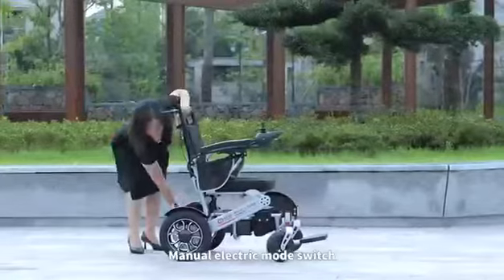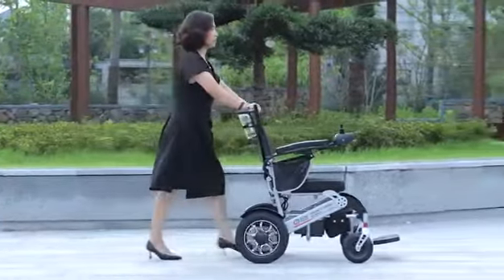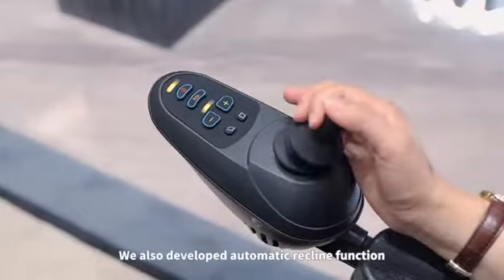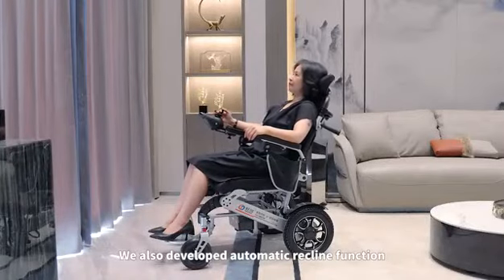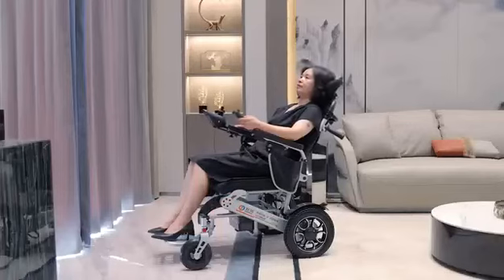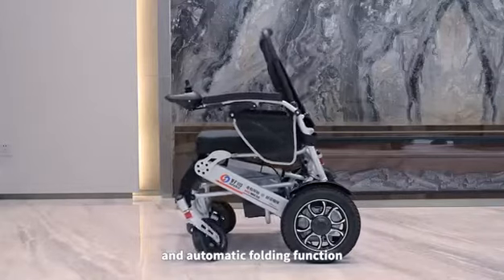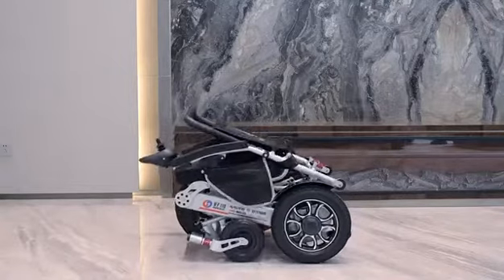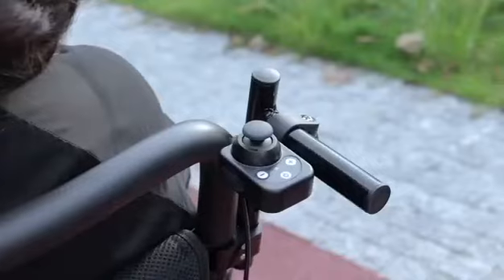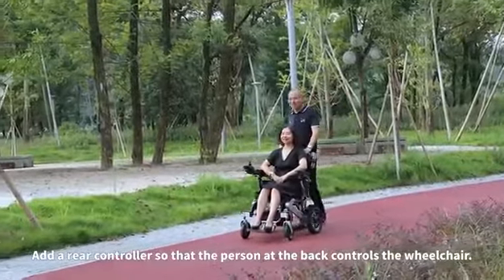Features a manual and electric mode switch. We also developed an automatic recline function and an automatic folding function. You can add a rear controller so that the person at the back can control the wheelchair.